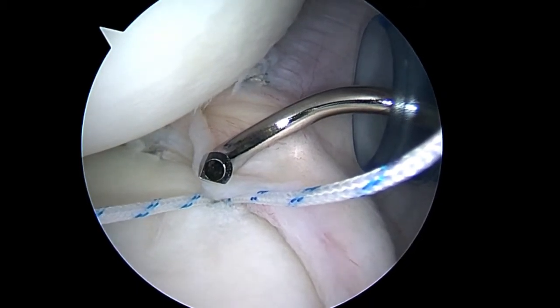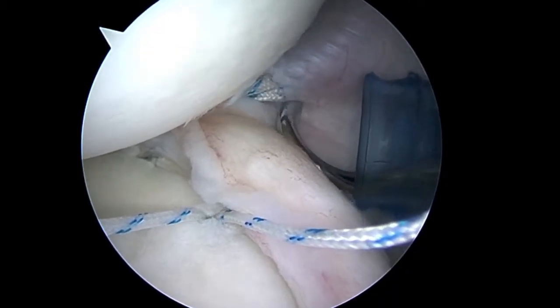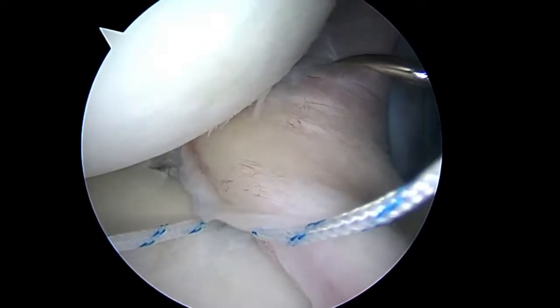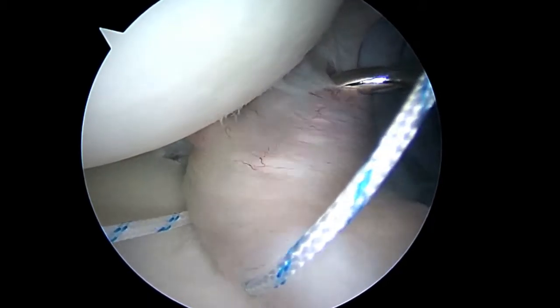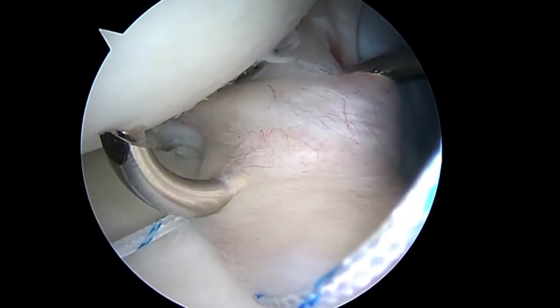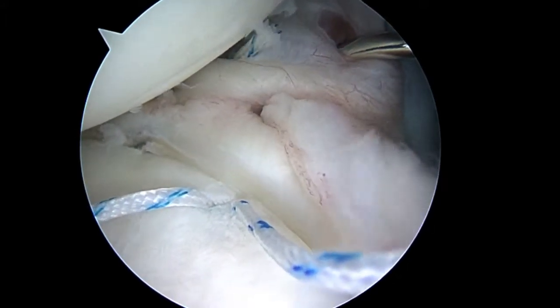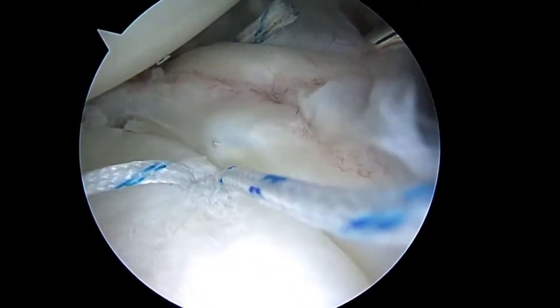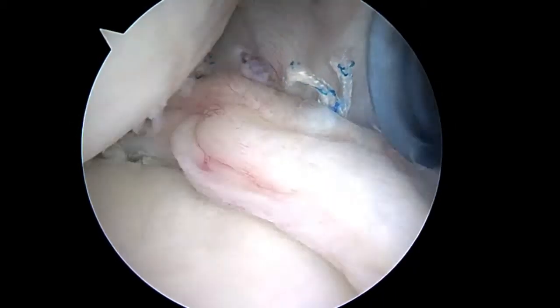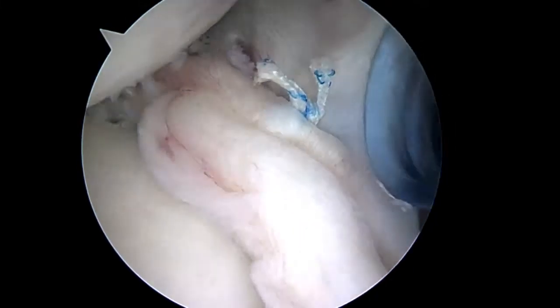So we're getting ready to make our second stitch. You can see the anchor — we're going to commit to the capsule right about here. So we've got two mattress sutures in the back. That really has to tighten things up a bit.